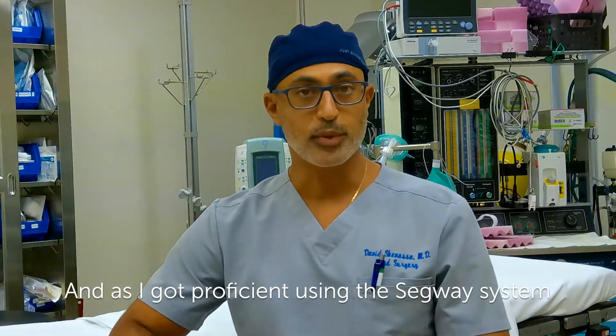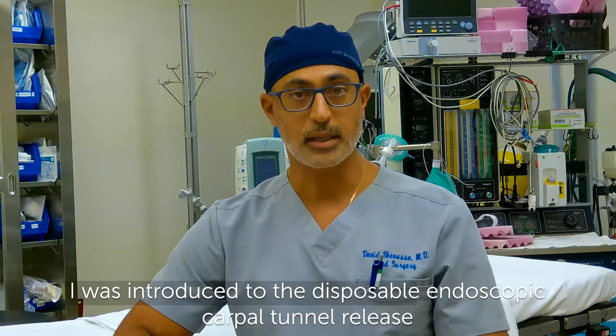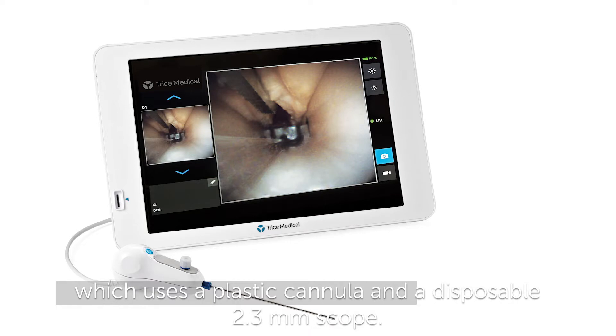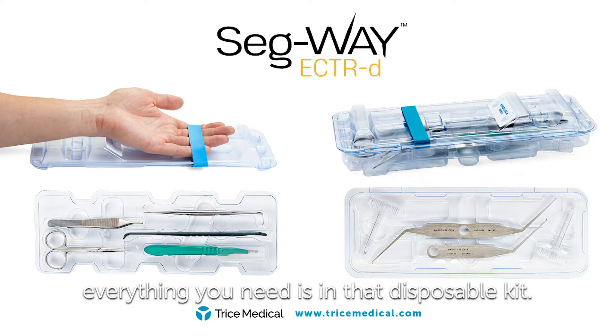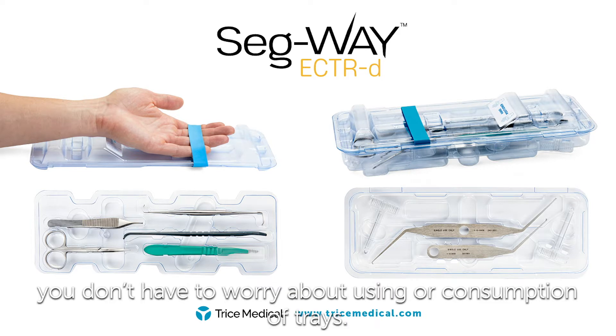As I got proficient using the Segway system, I was introduced to the disposable endoscopic carpal tunnel release, which uses a plastic cannula and a disposable 2.3 millimeter scope. It's a very simple system — one tablet, one wire. You put it on a mayo stand, and as far as instrumentation goes, everything you need is in that disposable kit. So you don't have to worry about sterilization of other trays or consumption of trays.